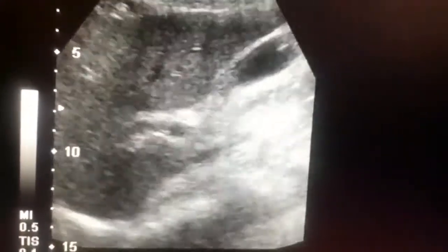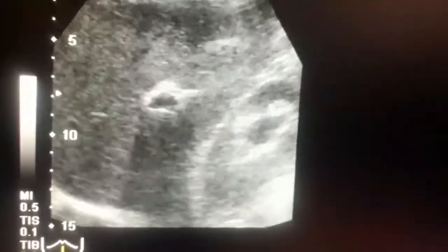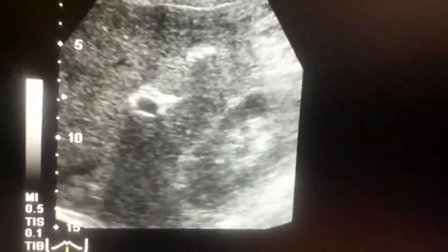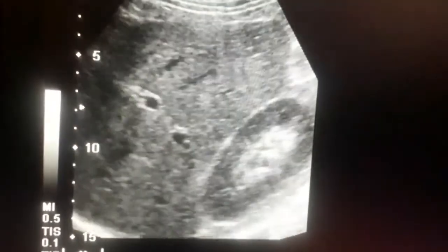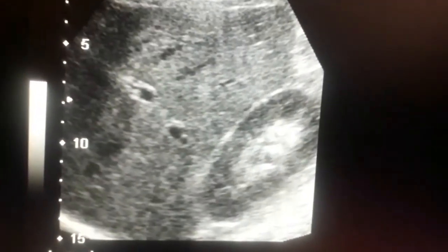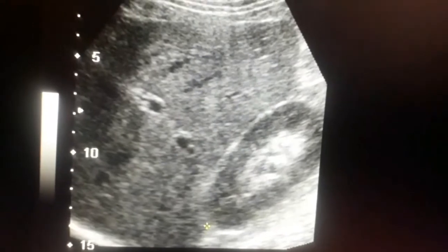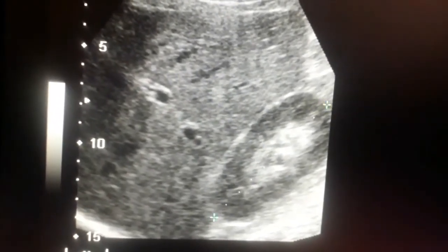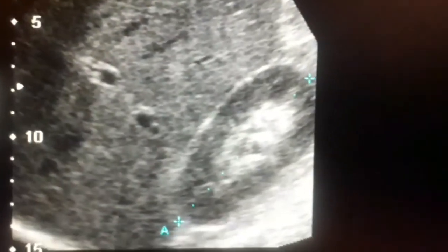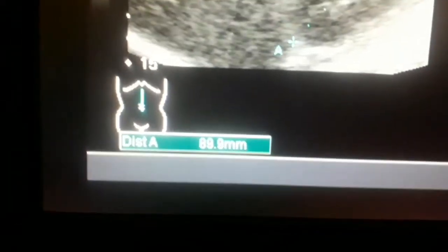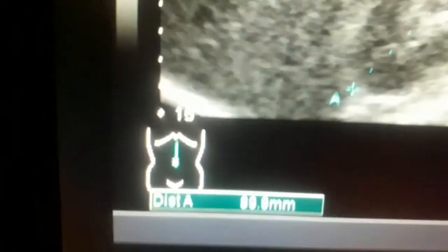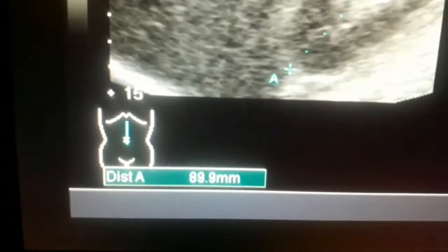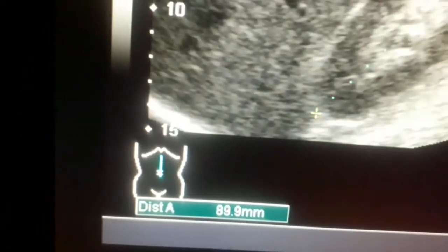The obstruction could be distal to the kidney — in the ureter or somewhere else in the distal part. I am now measuring the size of the kidney. Normally its length is about 9 to 10 centimeters and the thickness is about 4 to 5 centimeters. You can see the measurement on screen.